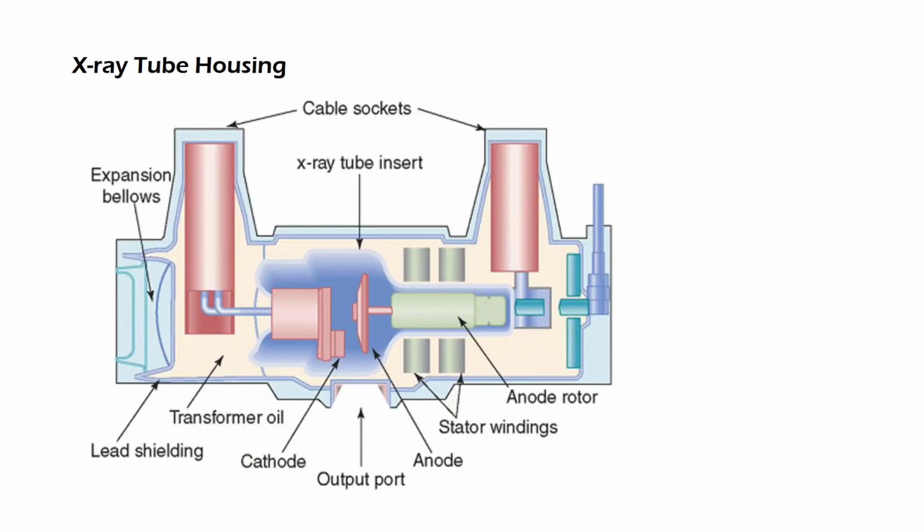X-ray tube housing. The X-ray tube, often referred to as the insert, is installed in a housing providing the structural support required. Tube housings also provide mechanical protection against the impact on tube envelope. The space between housing and envelope is filled with transformer oil serving as electrical insulation and for heat removal from the envelope surface, which is heated by the infrared radiation from the anode.